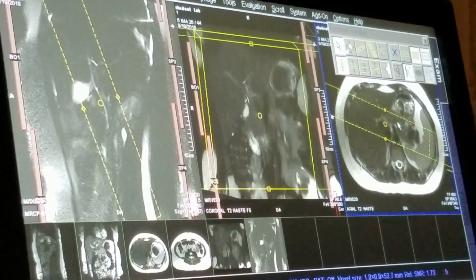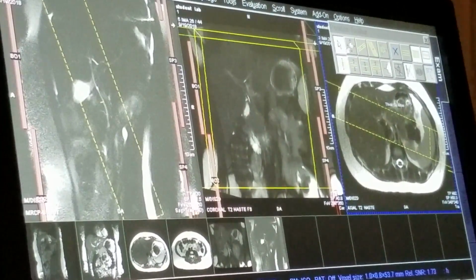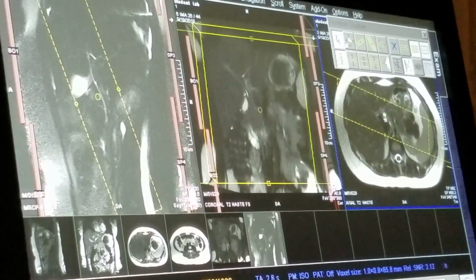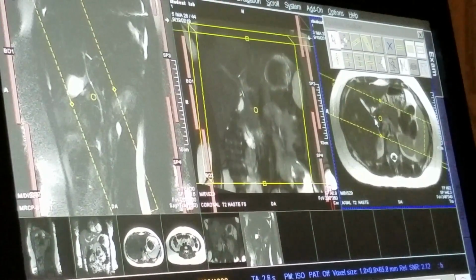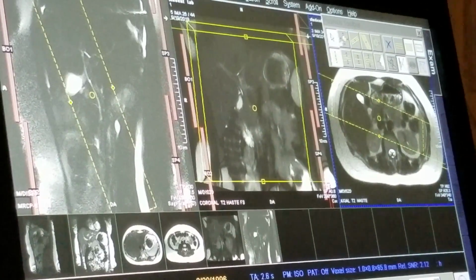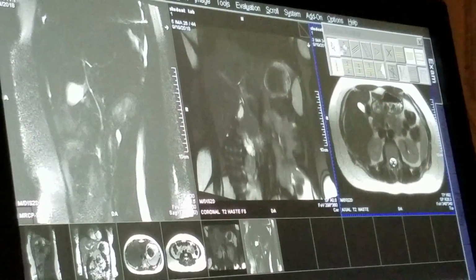Now you scroll through. See, I'm just grazing the body, the pancreatic duct in the body of the pancreas, so I'm going to make it a little thicker there. So I clearly have the pancreatic tail, there's the body, here's the common bile duct here, and that should do it. Any questions about that?